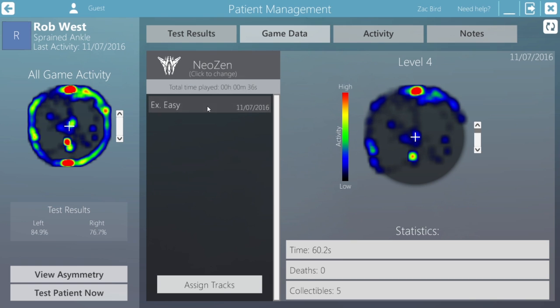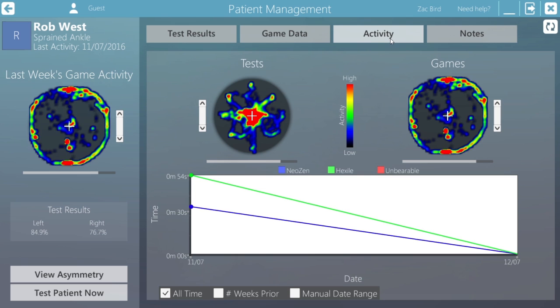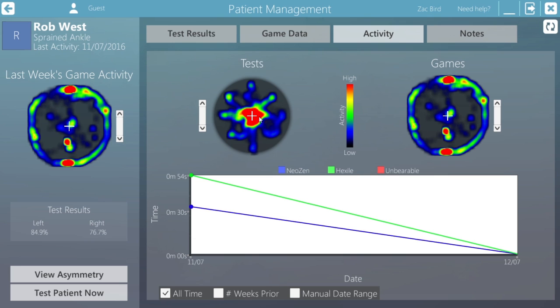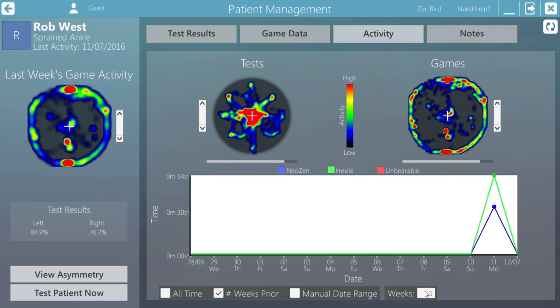You can look at the sum of this activity by clicking on the Activity tab next to the Game Data tab. Here you will see a graph of the patient's activity and a total activity map over the set time period. You can change the time period with the options provided. Using this feature, you can keep track of how often the patients are doing their exercise and their strengths and weaknesses while they're playing. At first, we would expect to see a patient's activity map favor their uninjured side, and for this to even out over the course of their recovery.